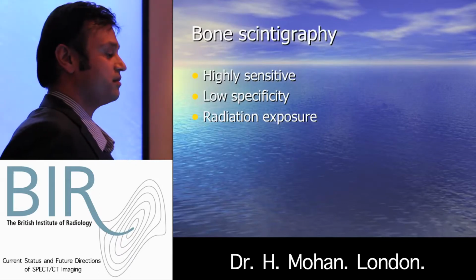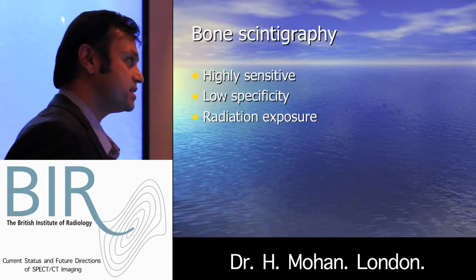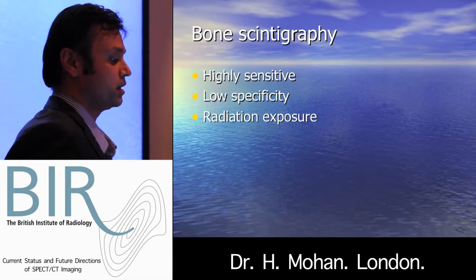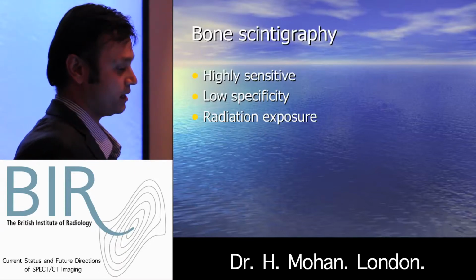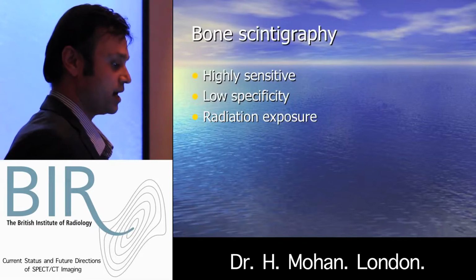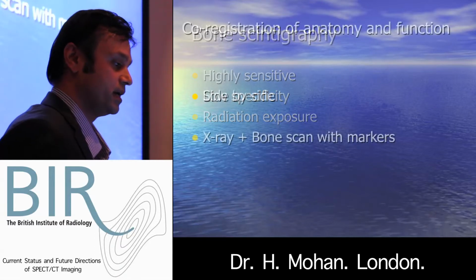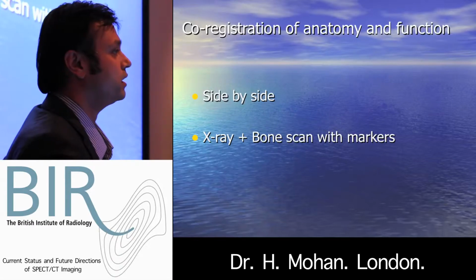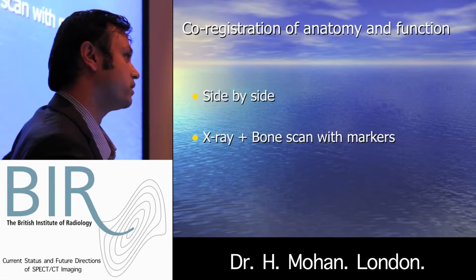So with bone scintigraphy, the plus point is that it's highly sensitive and therefore able to detect most of the problems, but because of the lack of clear anatomical definition, the specificity is lacking, and of course the radiation exposure is always put forward as a negative quality. So the next step was to improve on bone scintigraphy, to combine it with X-ray.